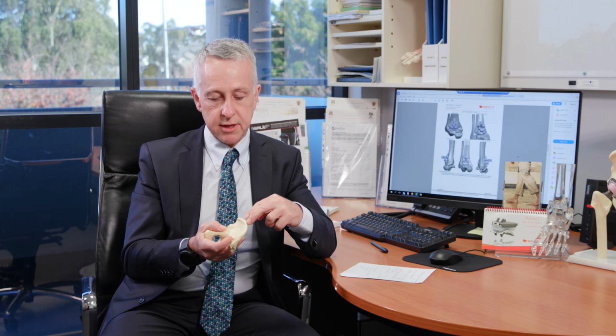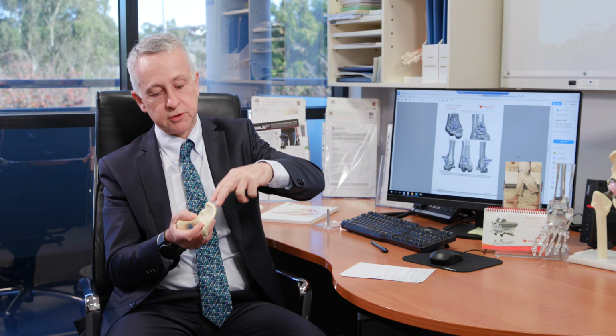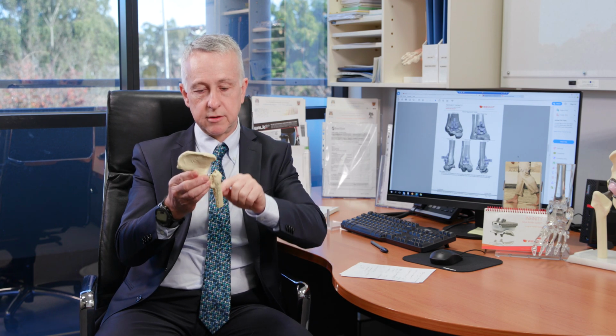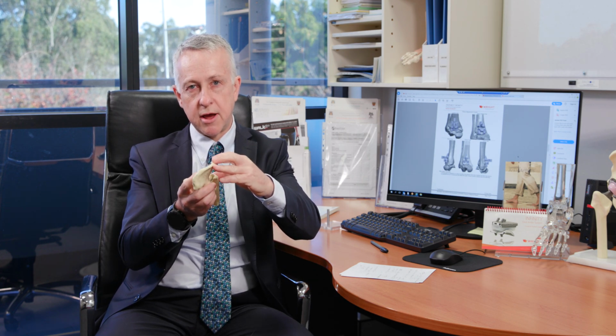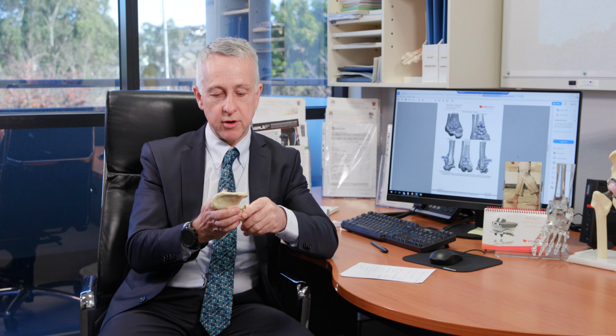So what I use is navigation in theatre, and navigation is where we put some sensors on the femur and the pelvis. That gets picked up by a camera, which is connected to a computer, and that gives us real-time feedback in terms of component alignment and soft tissue balancing. The things that we're trying to reproduce are the leg lengths, and we're trying to reproduce the offset. The offset is this distance here, and that affects the muscle tension and how well the hip functions. If we reproduce the patient's anatomy, then we've got the best chance of a stable hip that provides good long-term results.